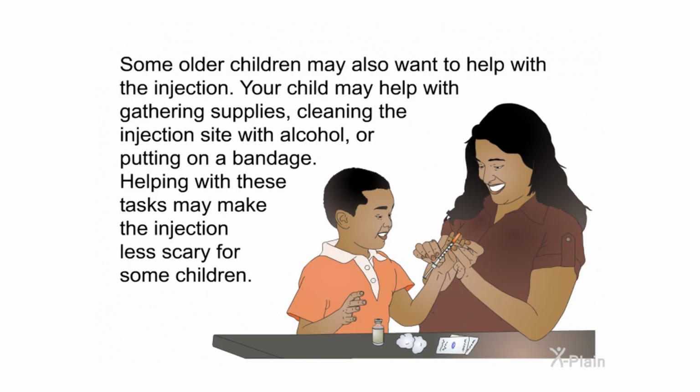Some older children may also want to help with the injection. Your child may help with gathering supplies, cleaning the injection site with alcohol, or putting on a bandage. Helping with these tasks may make the injection less scary for some children.